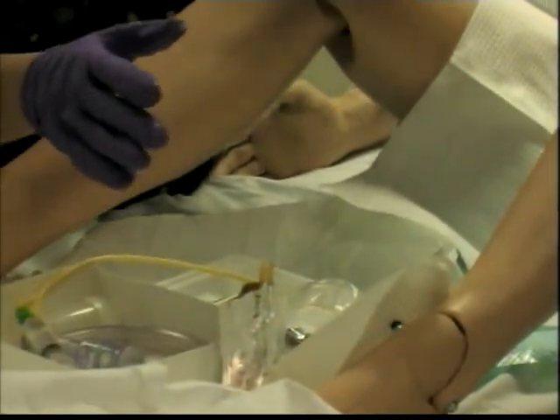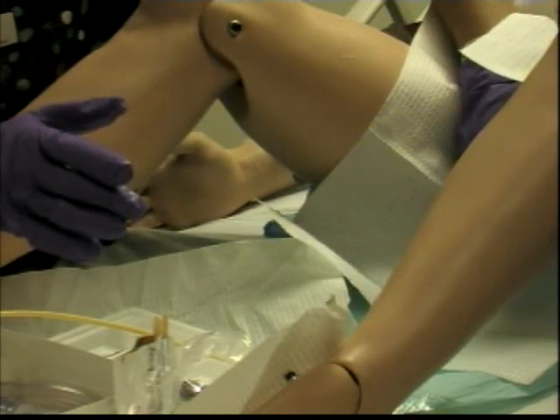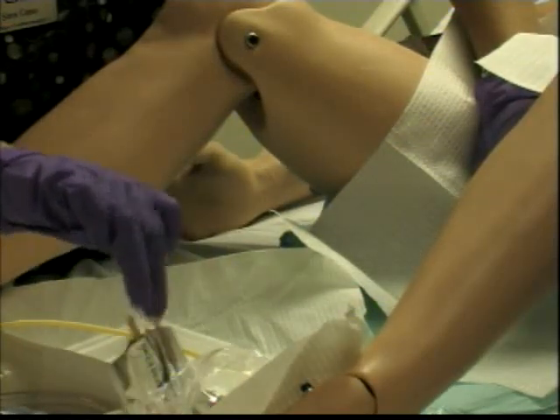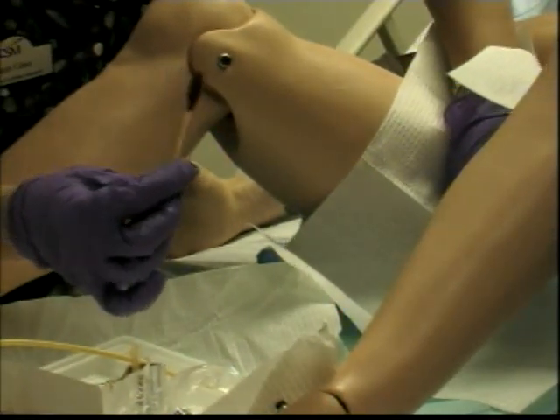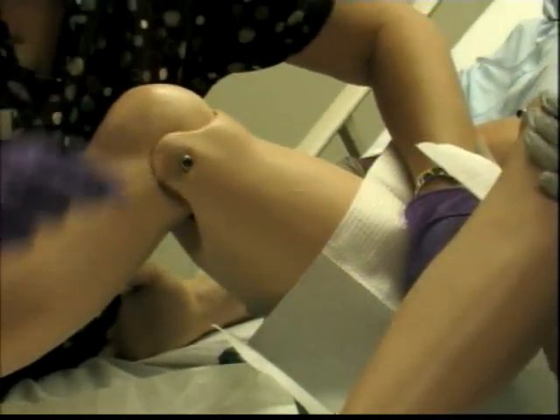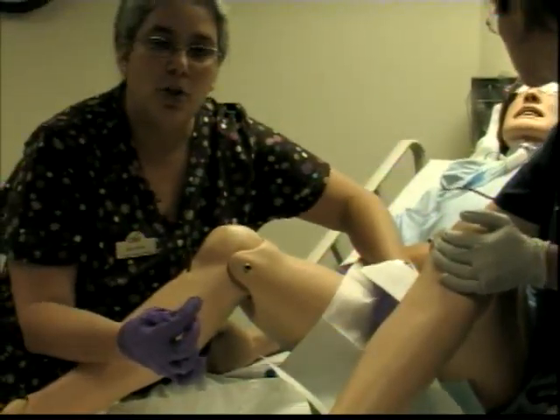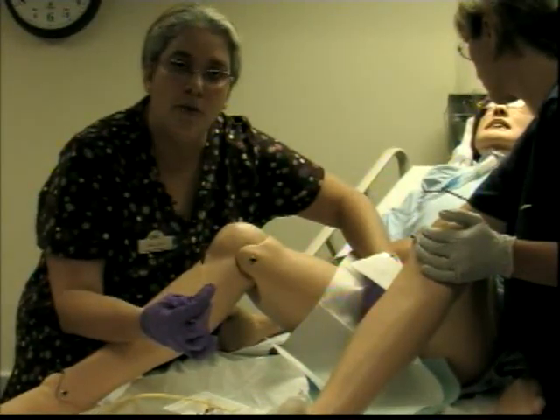Now I'm getting ready to insert. My non-dominant hand is going to come here and I'm going to expose and separate the labia. That hand now cannot come back to the sterile field at all — it stays here. I'll clean this area. One thing you want to make sure is to check the patient's allergies. If the patient is allergic to Betadine, use a Betadine-free package. If the patient is allergic to latex, use a latex-free package.